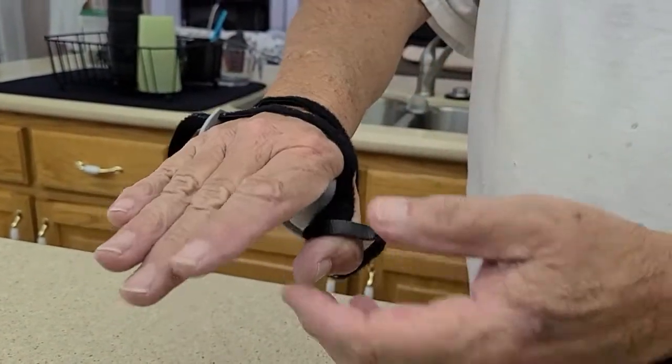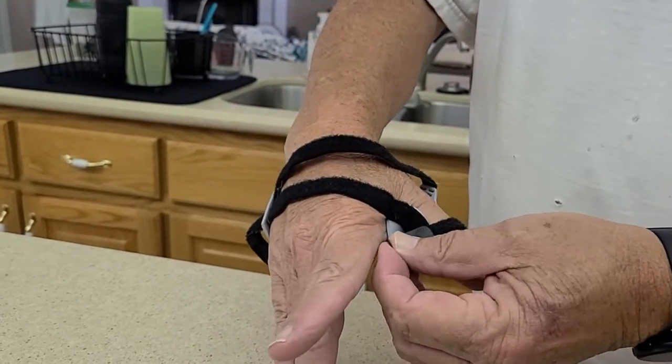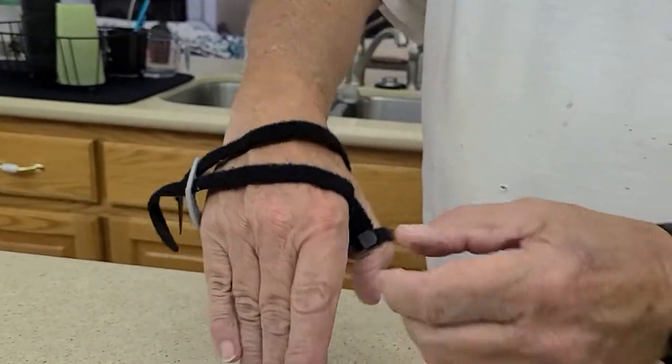The first thing I always do is go ahead and strap my thumb in — it's just Velcro, it's adjustable, so you just set it wherever you want it, and then you come back here.